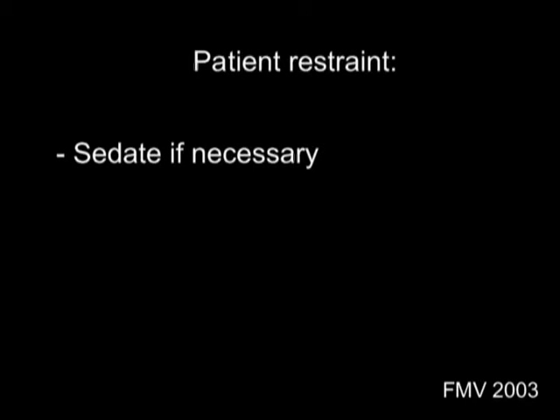Restrain the patient appropriately. In some cases, sedation may be indicated. It is not necessary to shave or to disinfect the aspiration site.